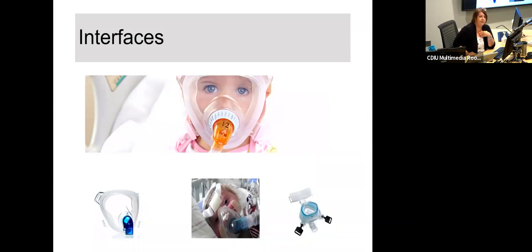They hold their breath. So if I approach a neonate with this high flow device at their face, there is a chance that they're going to hold their breath. That's fine, but if they're in the ICU and they're marginal to begin with, having an apnea and holding their breath and then desaturating creates a whole spiral of events that you're trying to avoid in the first place. Excuse me. So sorry.